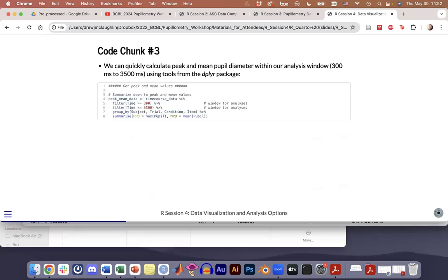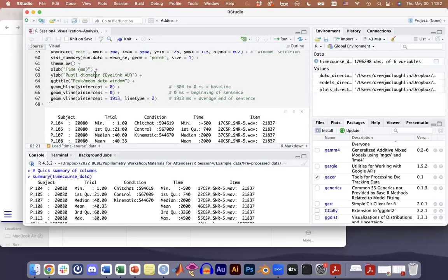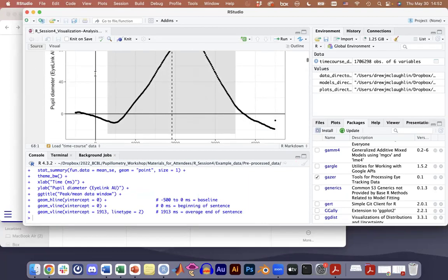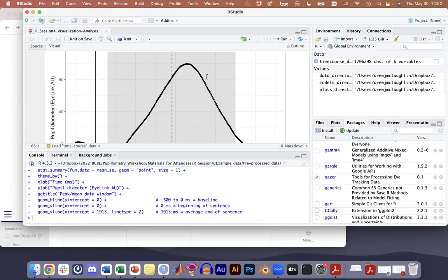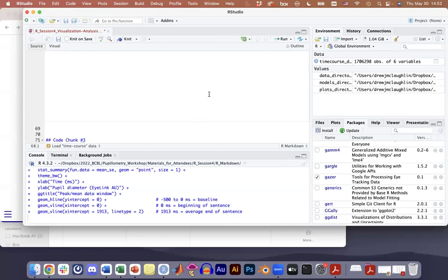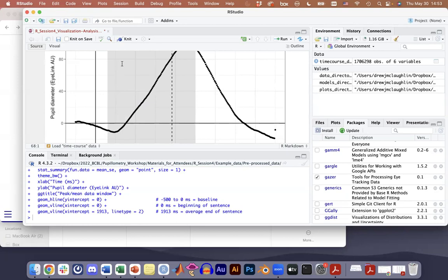Okay, so we've looked at our data and we've selected a window. Just as a note, you can use this plot function. If you were actually analyzing this data set and making decisions, you could move around this gray box as you so desire and see whether you think you're capturing the data. Note that the height, the top and bottom, of this gray box is arbitrary.